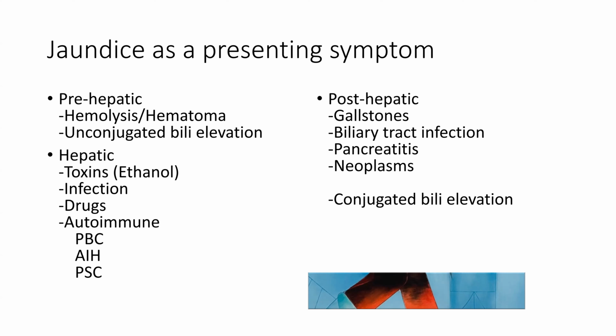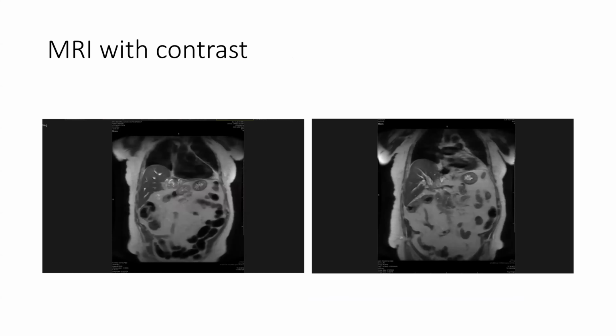And that led him to get an MRI study, which we see here in this slide. And admittedly, this is not the highly magnified view, but I think you can perceive here that in the liver, we have areas where we've got apparently slightly prominent biliary ducts.